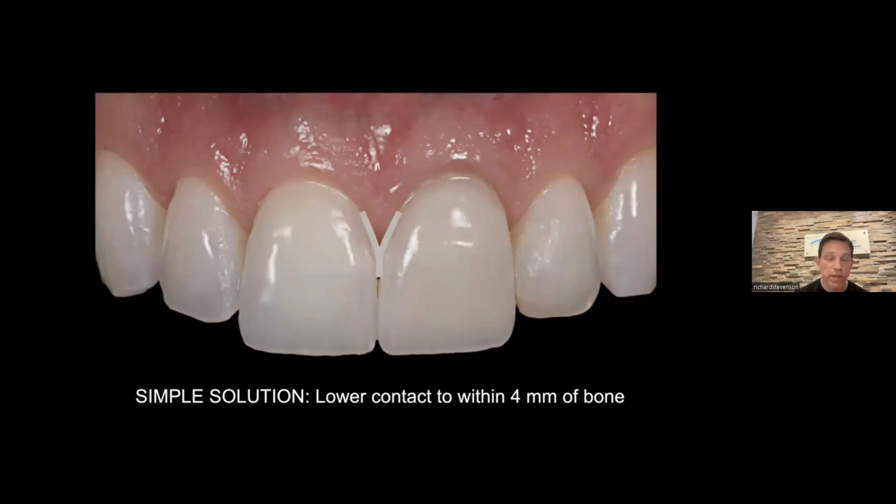The patient, fortunately, didn't care. This was not an issue for her. She just wanted them to be bold, bright, smooth, even, and mission accomplished. But I personally did not enjoy the result, and it got me to include this in presentations so that you can see the importance of at least considering this aspect while you're preparing teeth. So wrap the veneer more interproximally and avoid this issue.